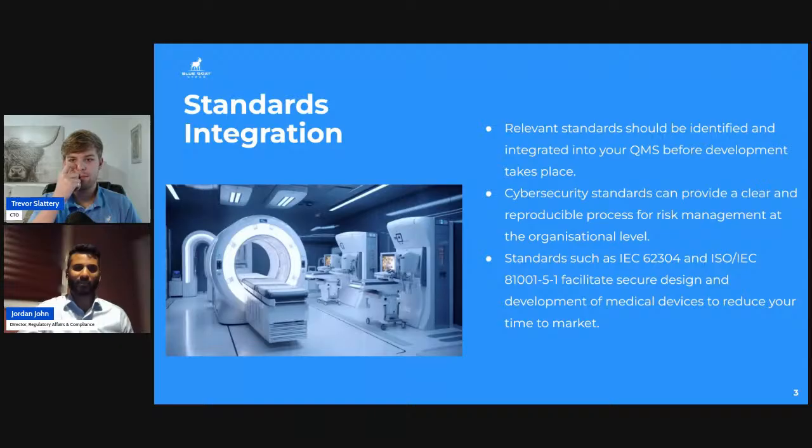It needs to be working. There needs to be evidence that it is working within your system. Really, in the FDA requirements, it mentions tying your security back into your design control, right? And that's really what you're doing, similar to all your other requirements in design control. It needs to be embedded.